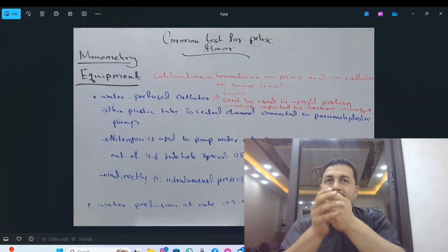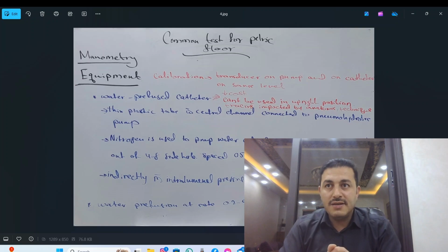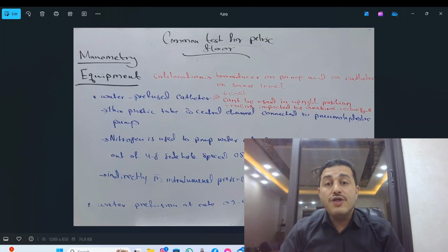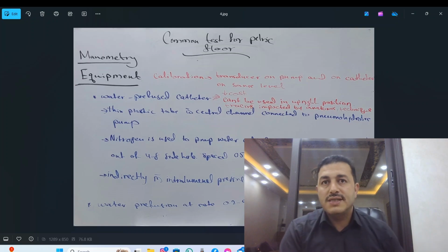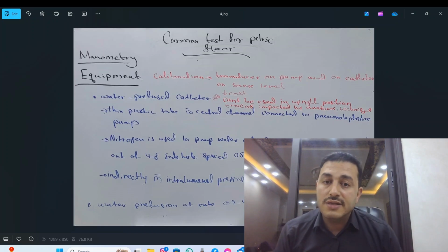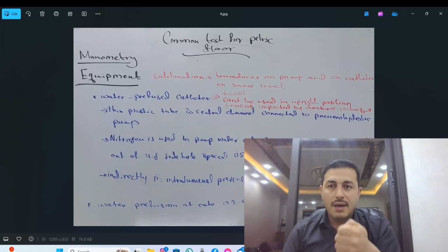So what we need is to pull through the manometer and to detect the change in the pressure through the whole anal canal. This is called the pull-through procedure. This is not required in other types, for example, in solid state catheter.